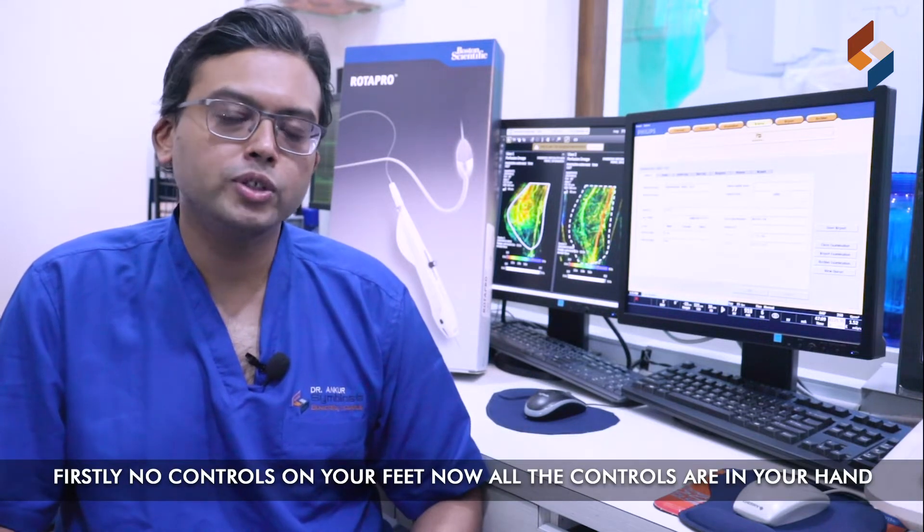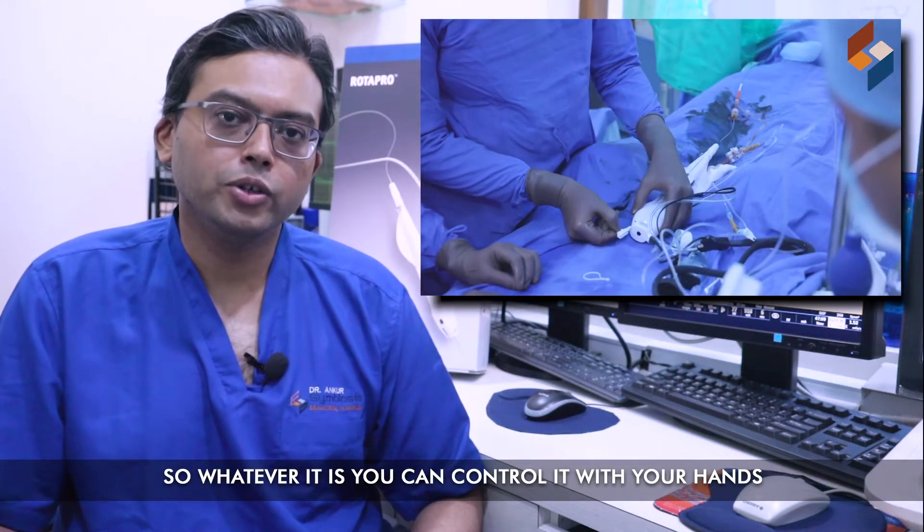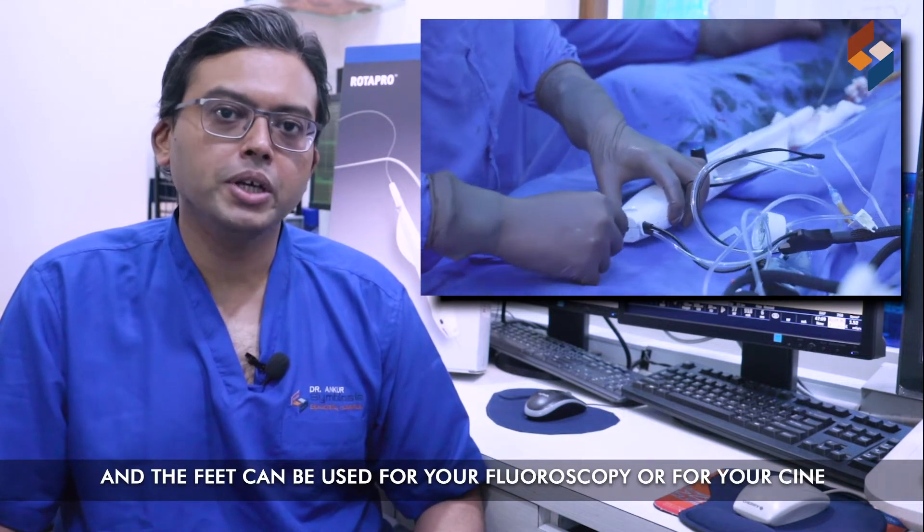Firstly, no controls on your feet. Now all the controls are in your hand. So whatever it is, you can control it with your hands, and the feet can be used for your fluoroscopy or for your cine.